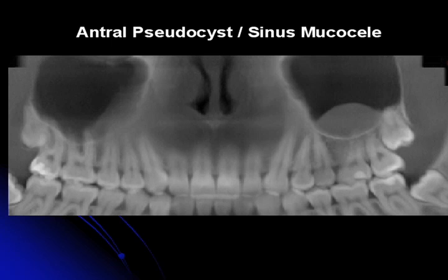Can I put an implant there? And of course, all the other things still apply. Is there enough bone? Do you need to do a sinus lift? But this won't affect your sinus lift because we can tell you what this is and that the sinus is already basically lifted there. So you can go ahead and do a sinus lift with lesions like this. So there's a lot of information that we can tell you.